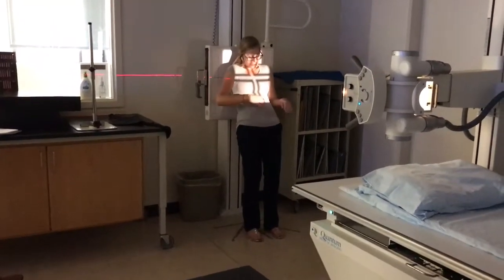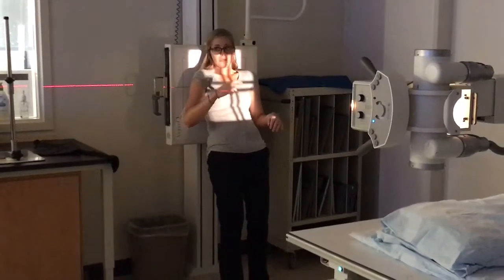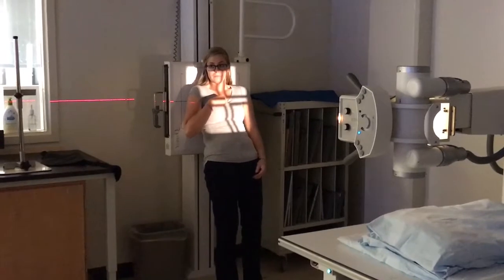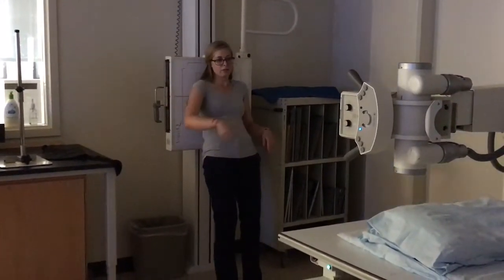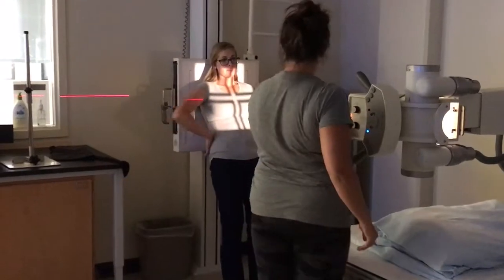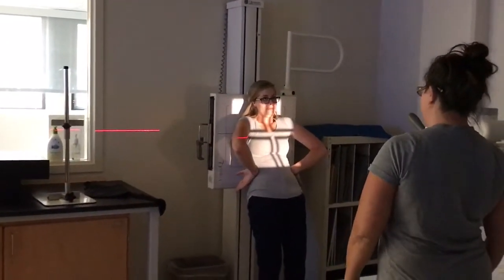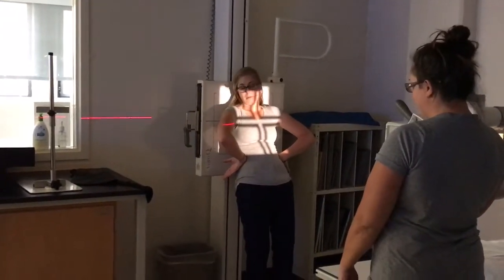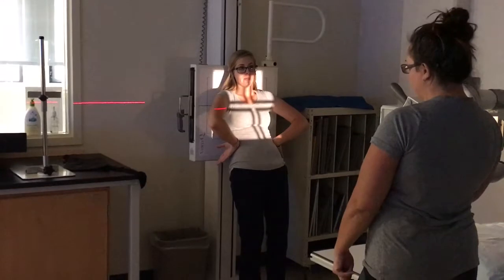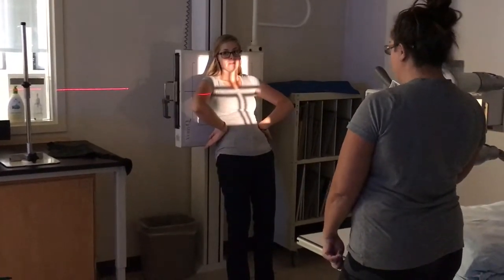So where is the central ray supposed to enter? Mid sternum. Mid sternum — so this is my sternum. Do we think I'm positioned right? How do I look? What needs to be changed though? I can't actually see — this is all you guys, you tell me.